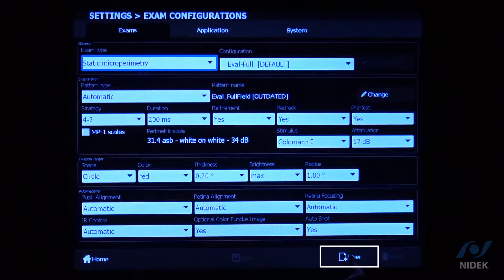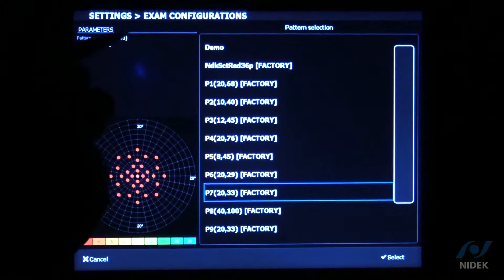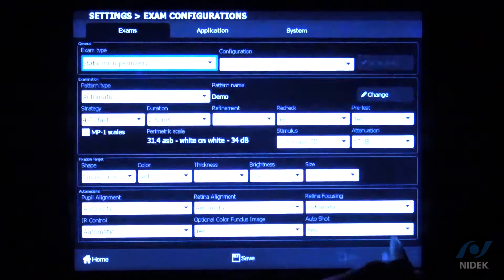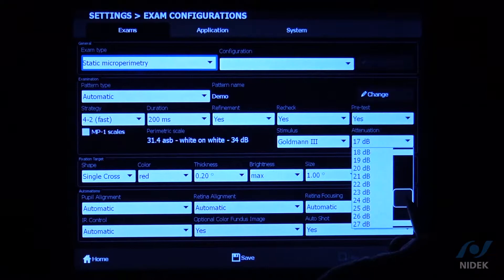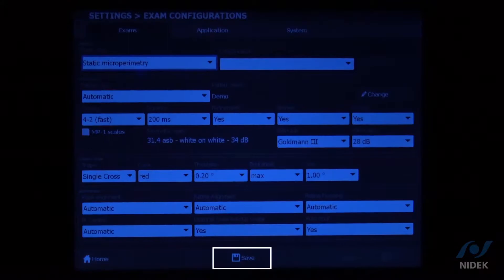We're going to stay in microperimetry. Click New in the bottom right-hand corner, then go up to the pattern name and change it from the factory name. I'm going to select the demo pattern that I created — you can see the four stimuli created in Navis EX. I'm also going to change the dB attenuation starting point to about 28, since this is just for demonstration purposes. You would set the dB attenuation starting point depending on your patient's visual acuity per exam. Now I'll click the Save tab and save it with the name 'demo.'